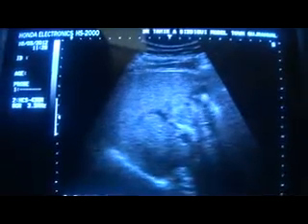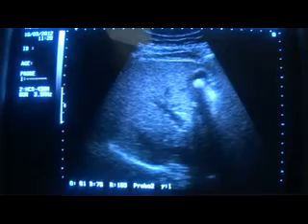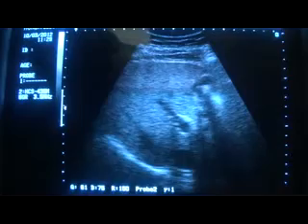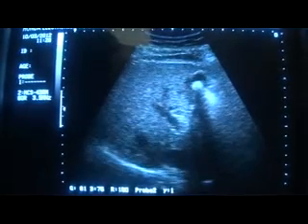This is the gallbladder. This tubular structure is the portal vein. This is the liver. A grading will be that it is fatty.